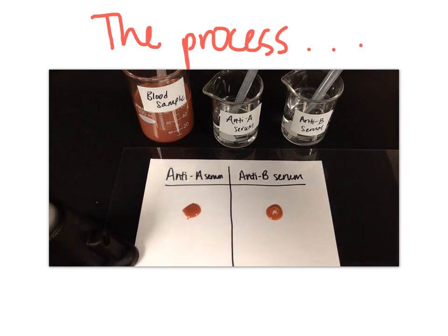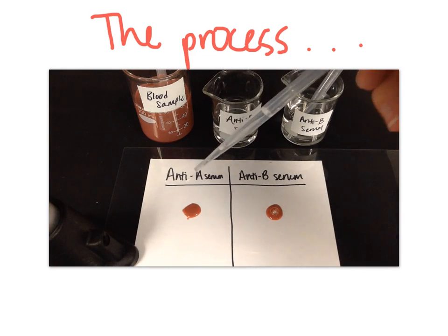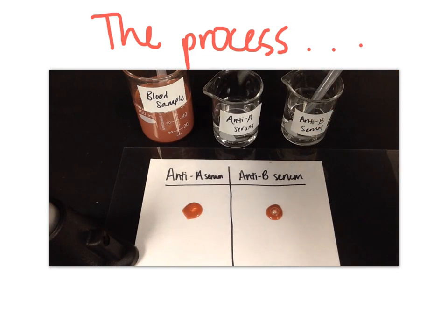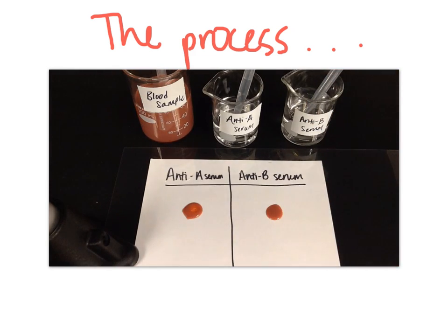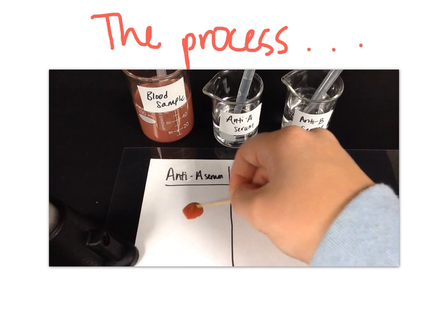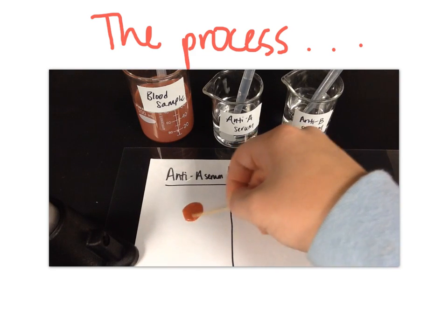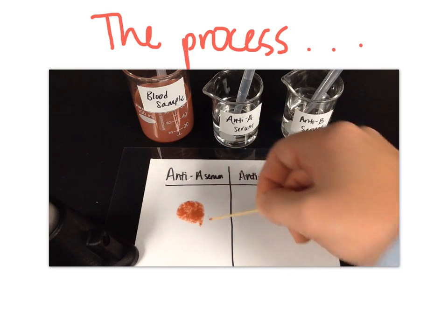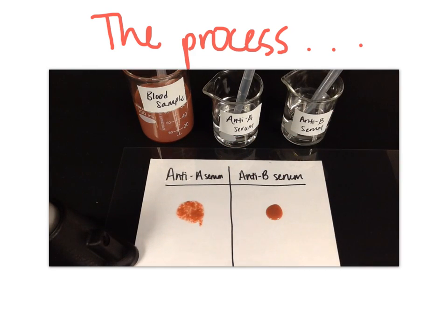Then on the anti-A serum, you take the anti-A serum and you just want to add 2 drops of anti-A serum. And then you're going to take a toothpick, and every time you do a new one, you have to have a new toothpick. So you're going to take your toothpick and you're going to mix. And if you kind of spread it out, you can see that there's clumping there. Okay, that's what we're looking for.